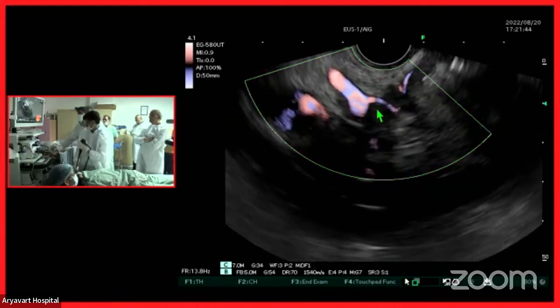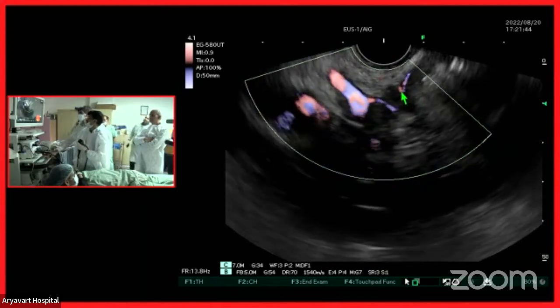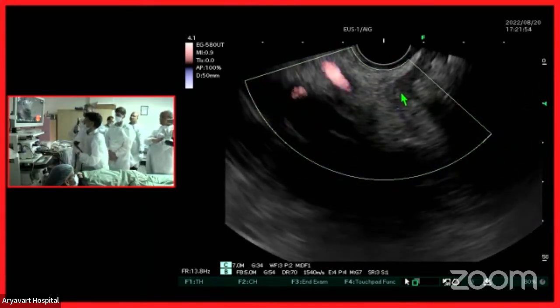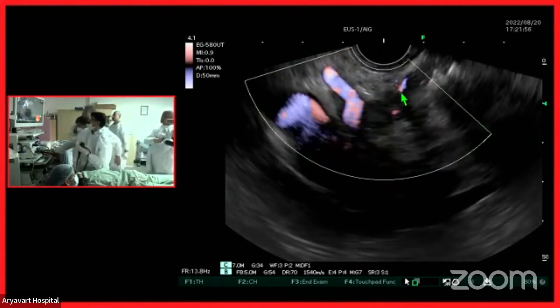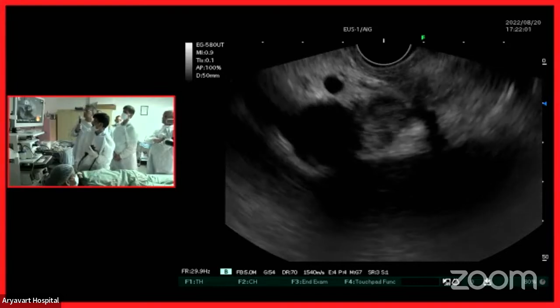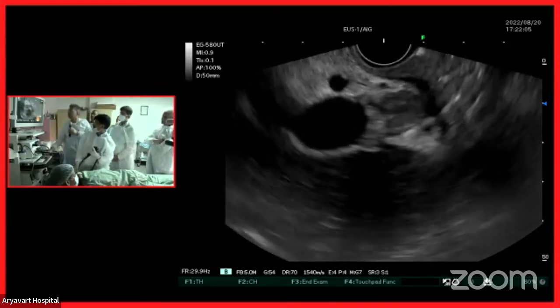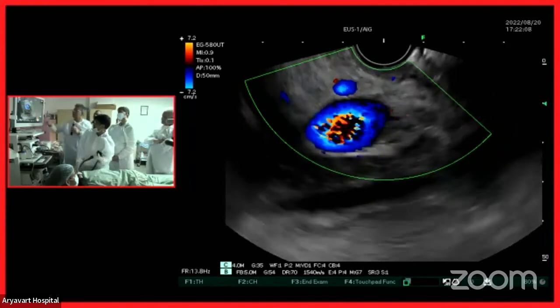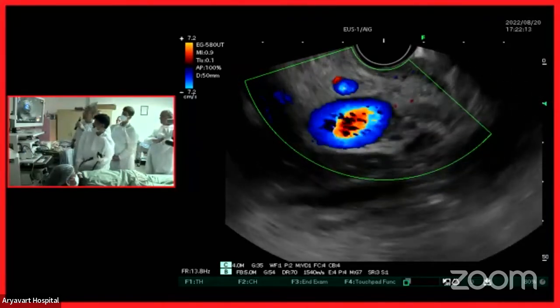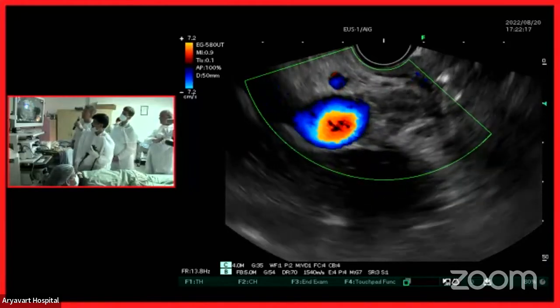Beautiful demonstration. Now this is the ligament. So this is the whole extent. I'm rotating through clockwise to anti-clockwise. The portal vein is encased or not encased? Portal vein, it's not encased for sure. There could potentially be a 90-degree contact with the tumor.